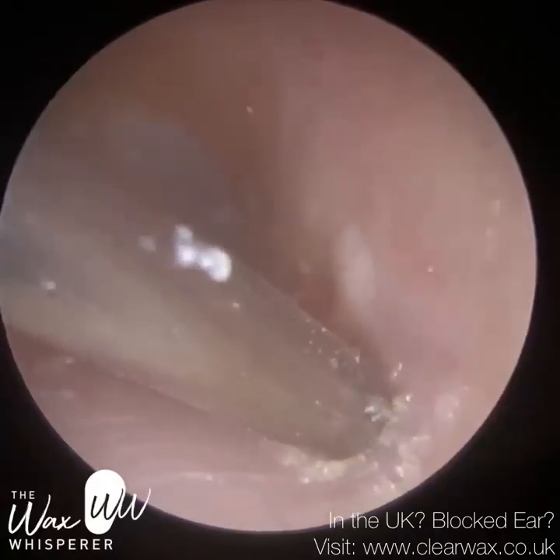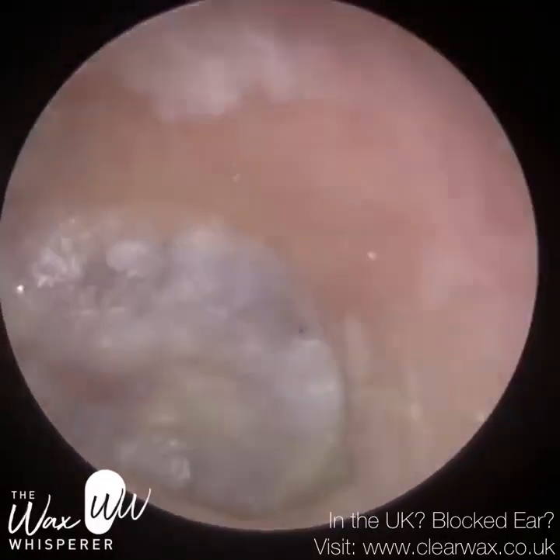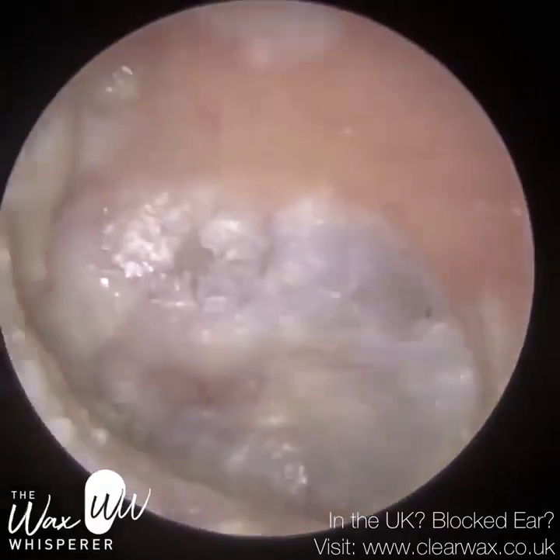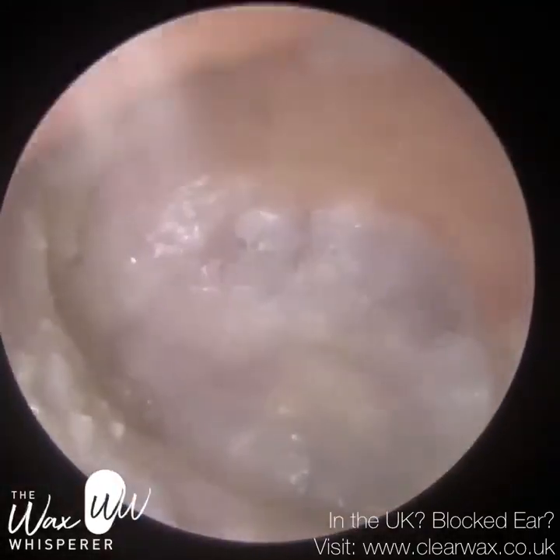So I'm just mopping up more at the entrance, and the outer layer of skin in this patient has, in some regions, that region I just removed there, been breached. The epidermis layer has been broken down because of the infection. So you just have to be really careful because the surface of the ear canal is very sensitive.